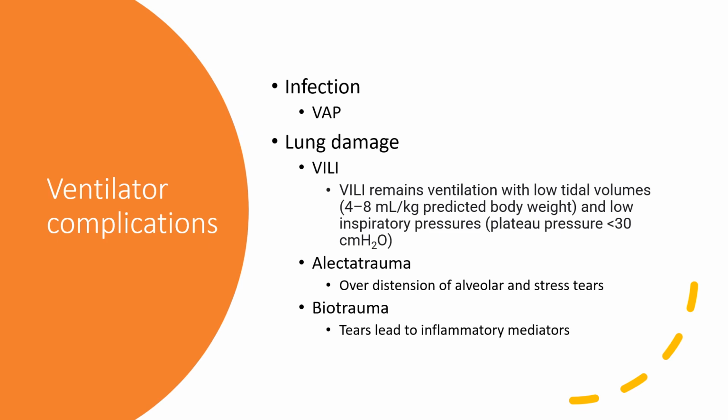So you really have to concern yourself about how long a patient stays on mechanical ventilation and what kind of tidal volumes are being delivered, to reduce the likelihood of ventilator-associated pneumonia, and to reduce the likelihood of atelectrauma, which could be best managed with proper PEEP levels. And you don't want to have any kind of stress tears in the alveolar space, because that could lead to biotrauma. All of these things can cause damage to the lung, and you have to be very aware of them.